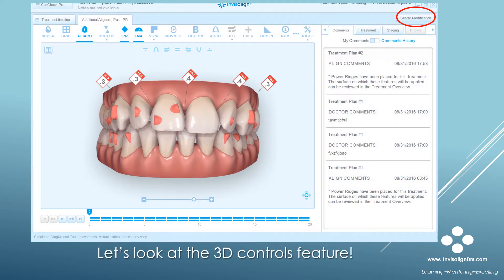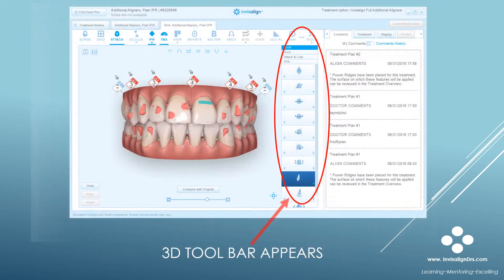Here's a screenshot of the KlinkCheck Pro interface. To turn on the 3D controls, click the Create Modification button, which is located in the upper right corner — you can see it's circled in red. When you do this, this toolbar will appear. Here it is: the 3D controls toolbar.